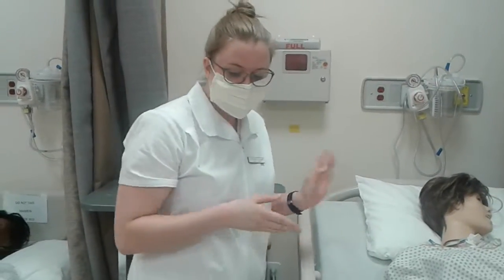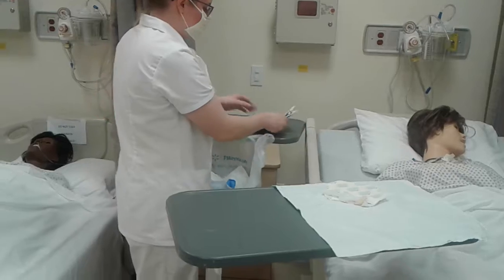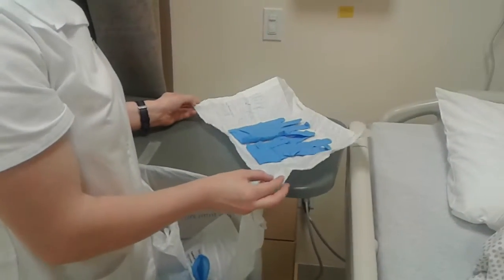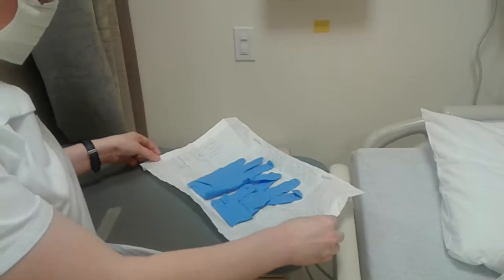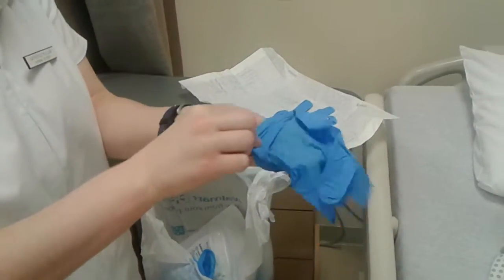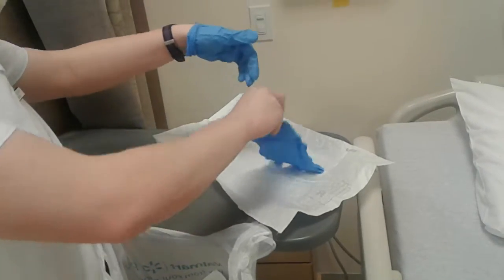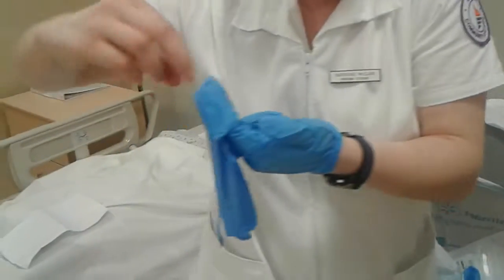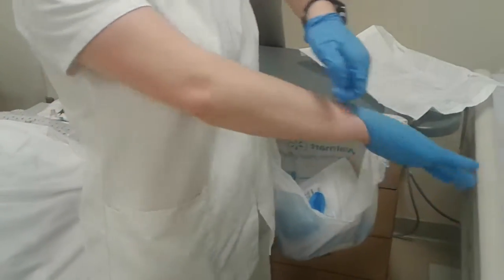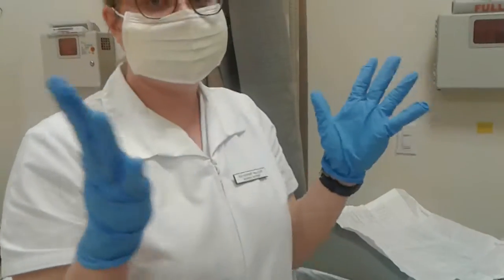So now that her central line is exposed, I can begin to put on my sterile gloves. Move these over here. Stay within my 1-inch border. I'm going to pick this glove up by the cuff and place my sterile glove on. And this one I'm going to pick up by the cuff and slide my sterile glove underneath, releasing, along with the undercuff of this one, maintaining my sterility.